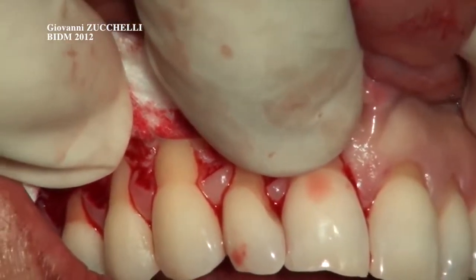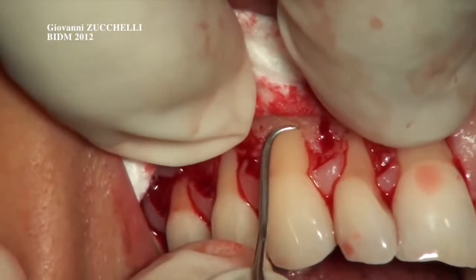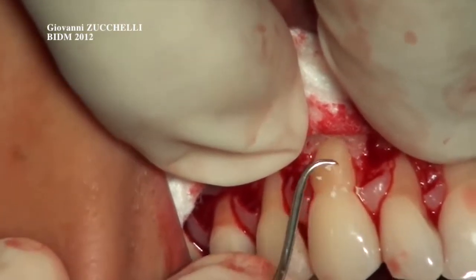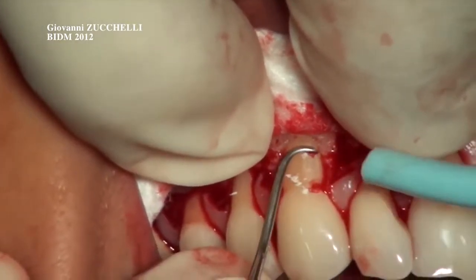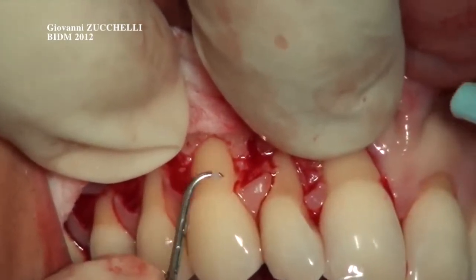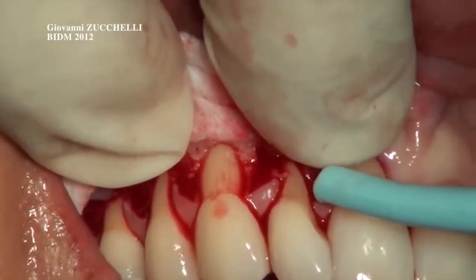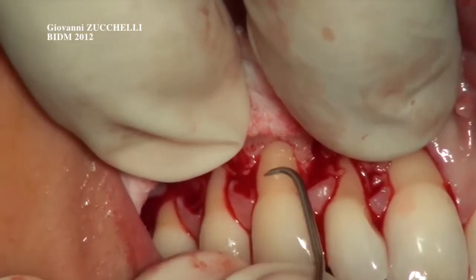Root planing is performed with mini-five curettes, starting always from the canine, and only that portion of the root corresponding to gingival recession plus probing pocket depth has to be grinded.